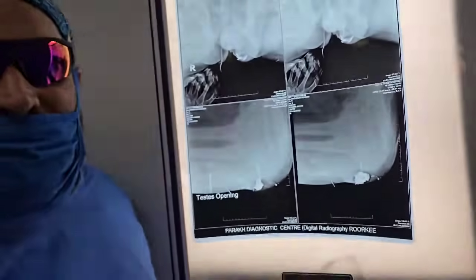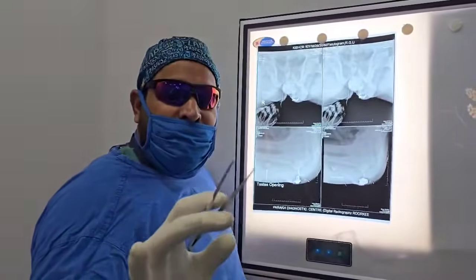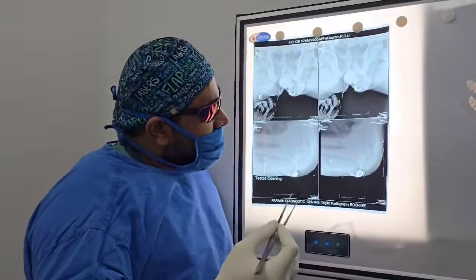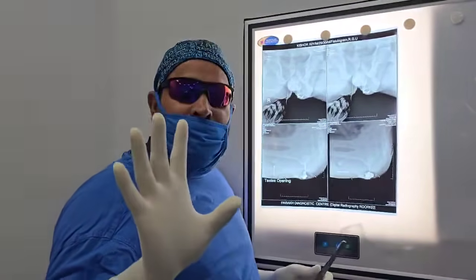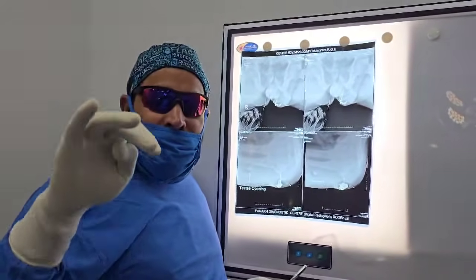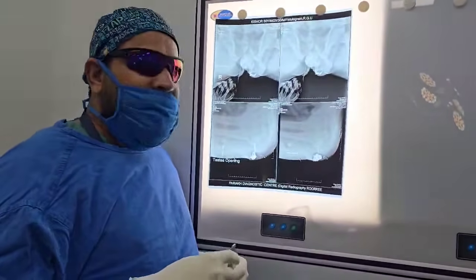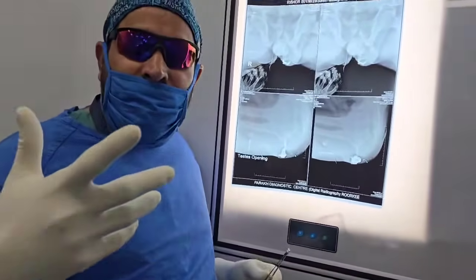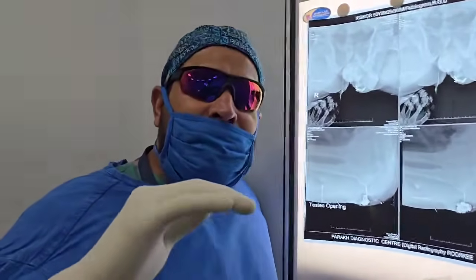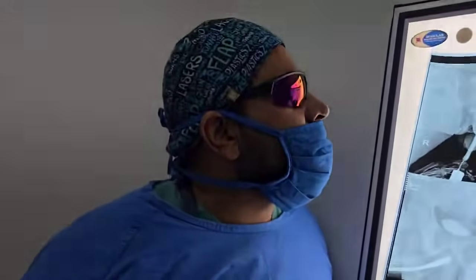So it is a very complex case of fistula. In this session of around 6 months, this is the most difficult case that I am going to operate today. Very important in this case, number one, is the laser, especially near the median raphe, where the tract is very much nearer to the urethra. What happens when we give huge energy, at the level of 10 watts or 12 watts? Sometimes there may be an injury to the urethra because the tract is very near. I will show you in this urethrogram, that is the RGU.